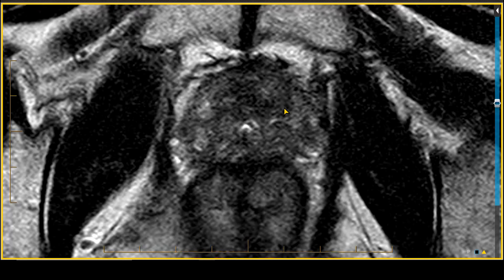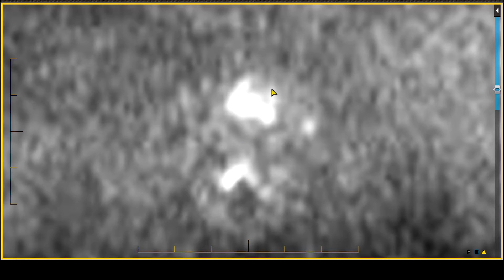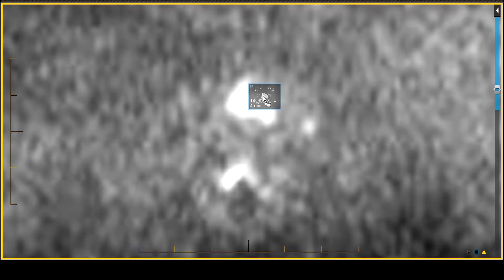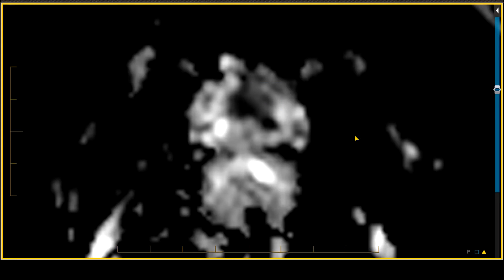This measures over a centimeter and a half in size. On the corresponding high B-value diffusion-weighted sequence — the B-value 1400 image — there is an area of very high signal intensity that extends into the area of the anterior fibromuscular stroma. On the apparent diffusion coefficient ADC images, this corresponds with an area of significant restricted diffusion, well below a mean of 1000, with ADC values as low as 600.